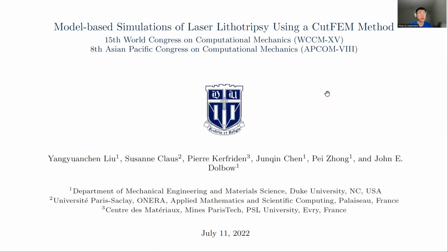In this presentation, I am going to introduce the model-based simulation of laser lithotripsy using a so-called CutFEM method. In this work, a relatively simple energetic model is developed based on a one-dimensional Stefan-Signorini model. The CutFEM scheme allows the interface geometry to be arbitrary relative to the mesh. Interfacial constraints were imposed weakly using a variation of Nitsche's method.